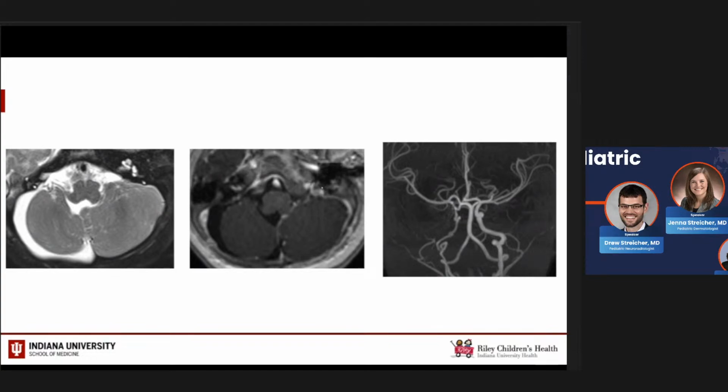Left image, axial T2-weighted sequence. Probably the most common posterior fossa anomaly you're going to see with patients that have PHACE syndrome is cerebellar hypoplasia. We can see that the right cerebellar hemisphere is small in size. We have that asymmetric prominence of the subarachnoid space overlying the cerebellar hemisphere. So, right cerebellar hypoplasia here.